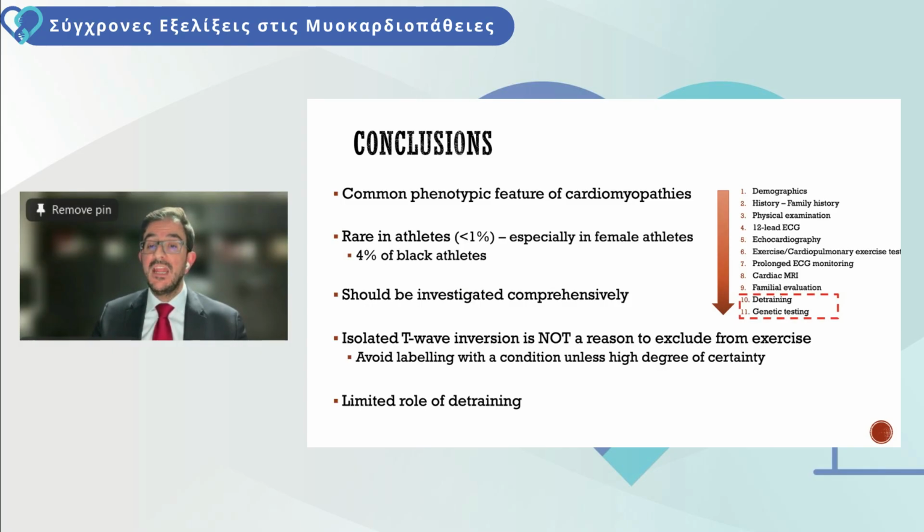Isolated T-wave inversion is not a diagnosis and is definitely not a reason to exclude someone from exercise. So please avoid labeling individuals unless you've got a high degree of certainty. And I also highlighted the fairly limited role of detraining, because of the challenges of detraining, particularly elite athletic individuals, and the uncertainty that exists even if those T-wave inversions resolve.